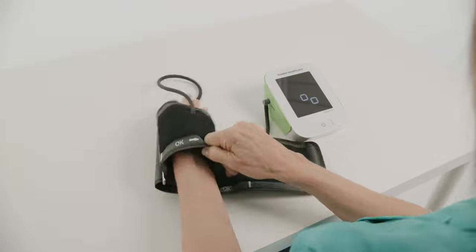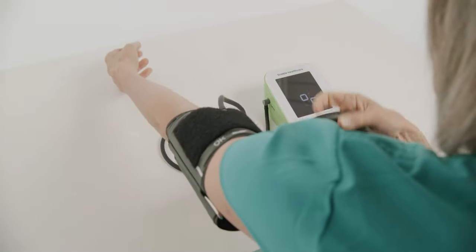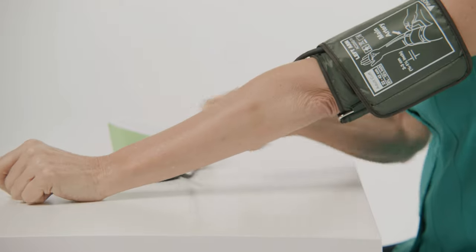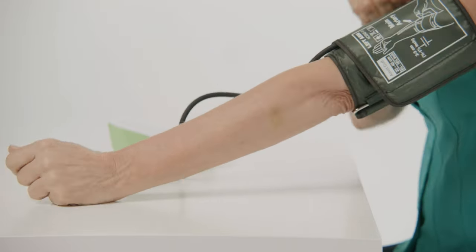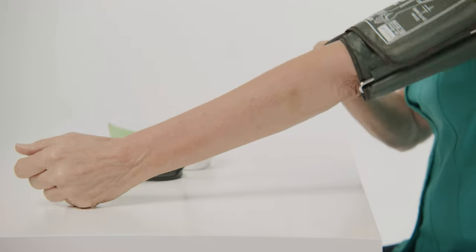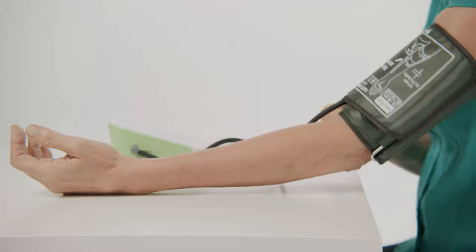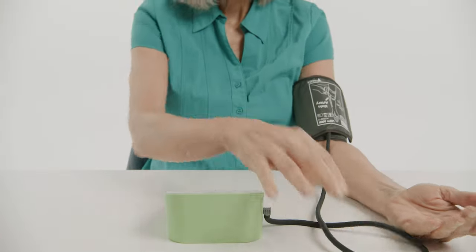Place the device in front of you and rest your left arm on the table with your palm facing up. Slide the cuff onto your left arm and align the tubing along the middle of your upper arm as indicated on the cuff. Make sure the artery line on the cuff is positioned over your artery. Adjust the cuff if necessary.